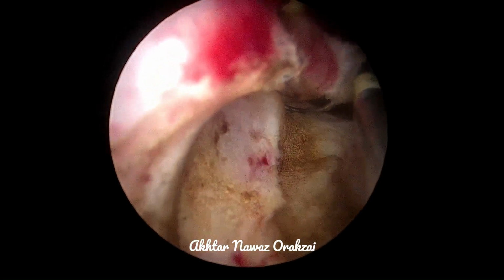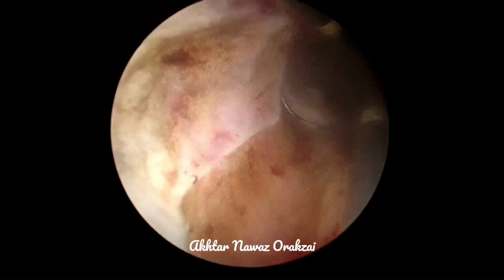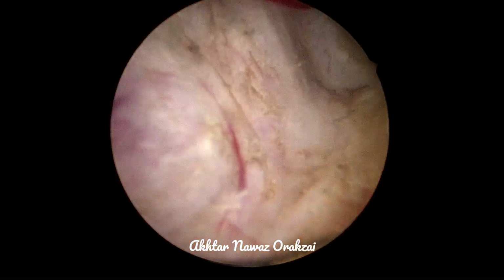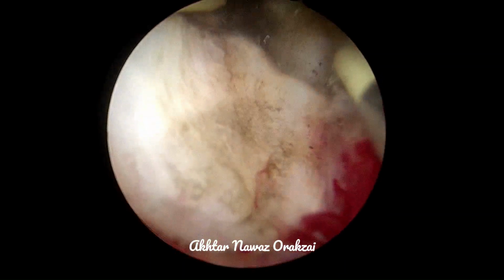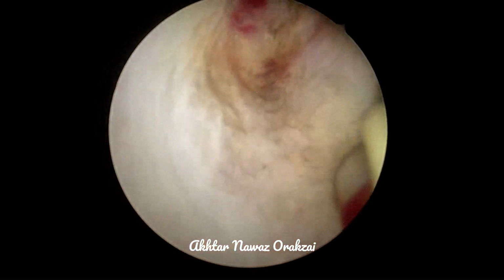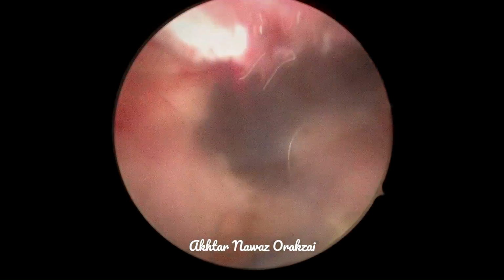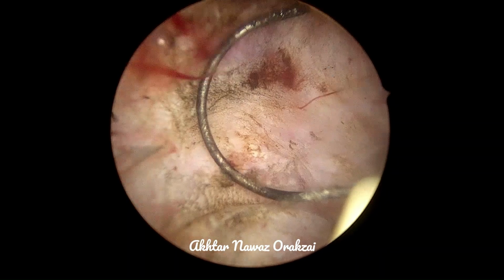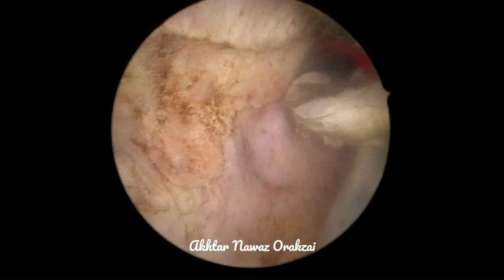So coagulate the area which was already resected on the left lateral lobe before going on to the right lateral lobe, so that it doesn't impair the vision. Starting from the 7 o'clock position and moving slowly and gradually upwards, you can see many fibers.